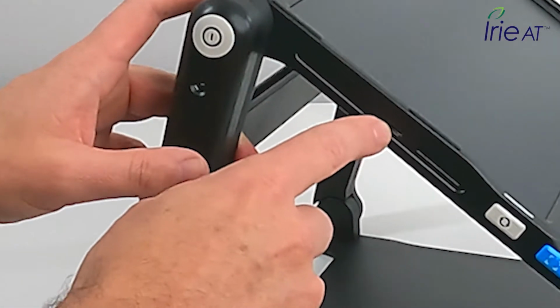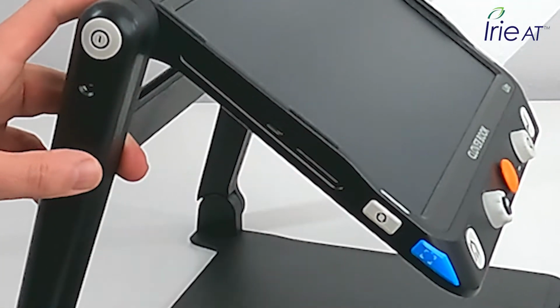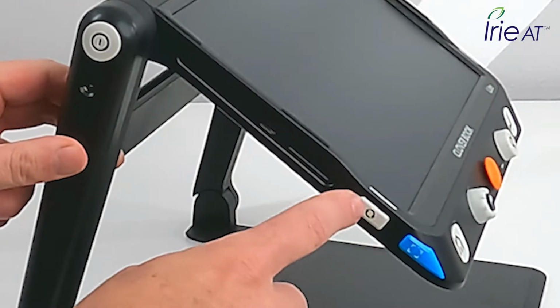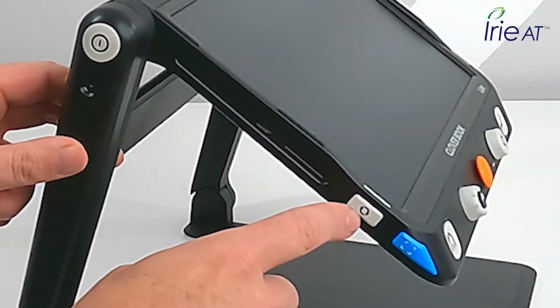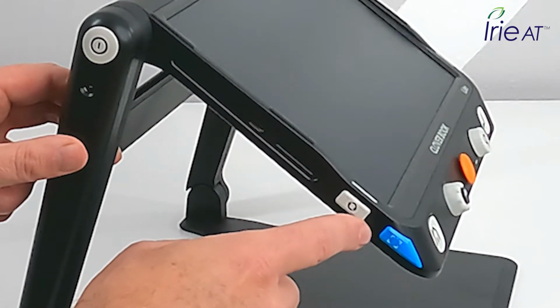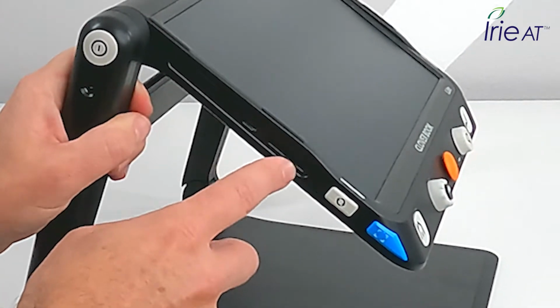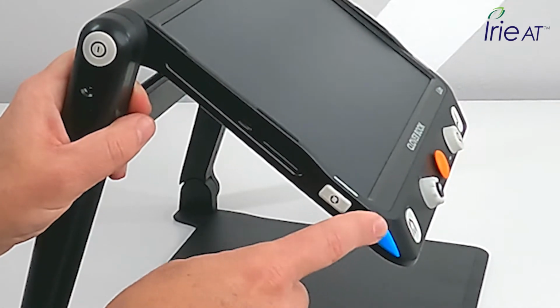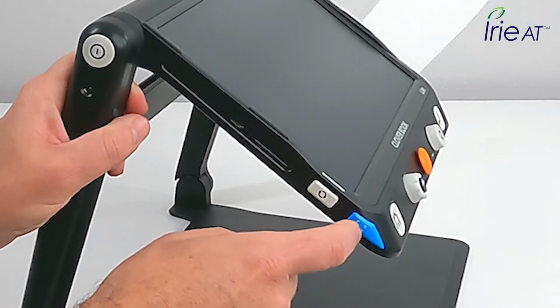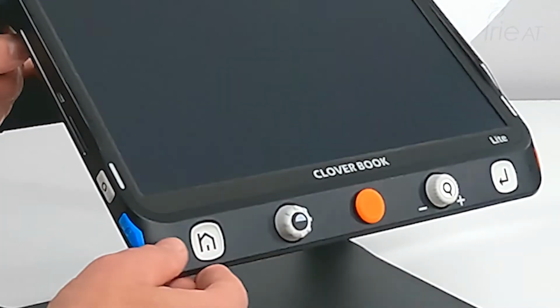We have a USB-C port on the left-hand side of the screen. An SD card port where you put in an SD card to put in pictures or take off pictures. Still going down the left-hand side, a rectangular button that has a circular icon on it, a black icon. That'll switch into the picture gallery to get your saved photos or get what's on that SD card. Just below that, there's a blue sort of partially triangular, partially rectangular button that has a little tactile line on it you can feel. That's going to be your lines and blinds. I'll show you how that works.